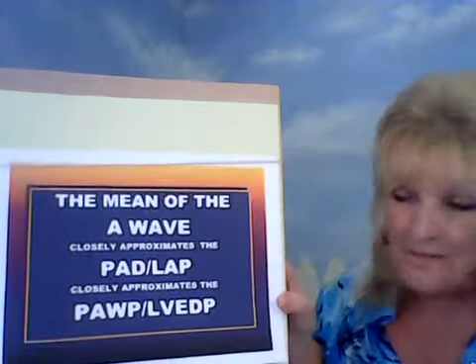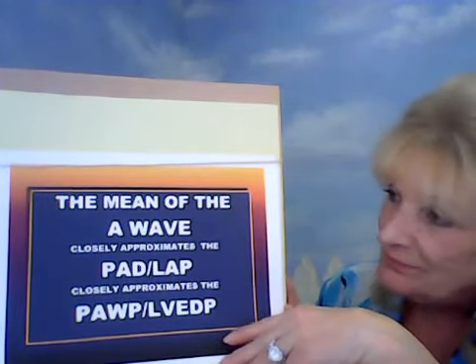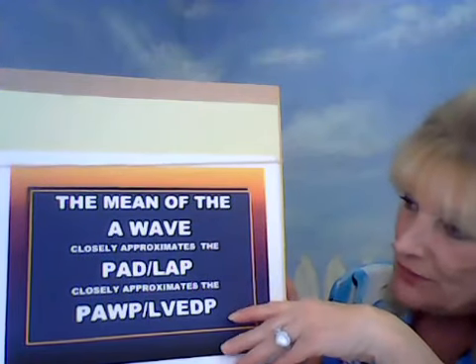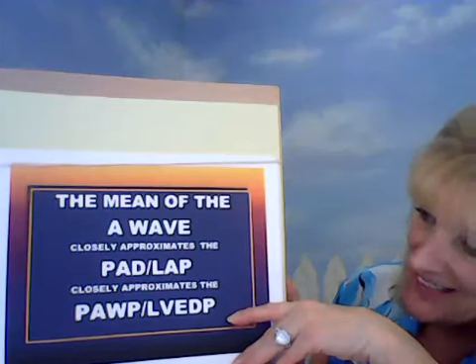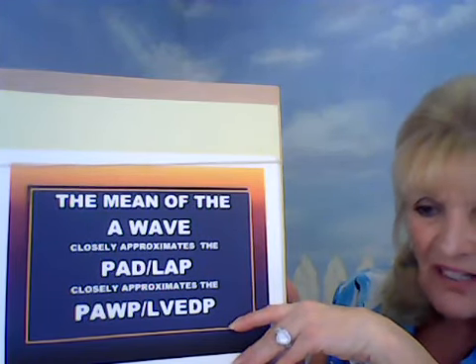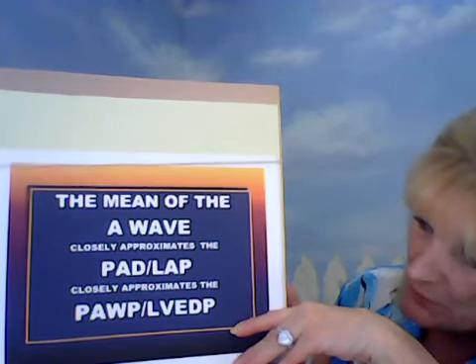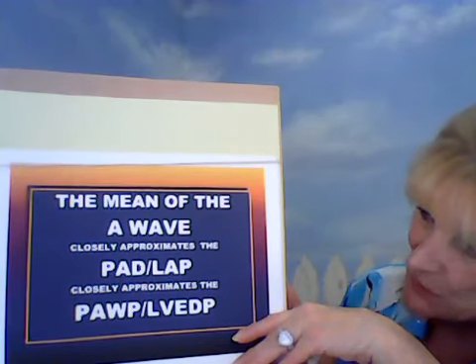This is very easy. Well, first of all, you know the mean of the A wave closely, or the wedge, closely approximates the pulmonary artery diastolic number, which is very similar to the left atrial pressure, which closely approximates the pulmonary artery wedge pressure and the left ventricular end diastolic pressure.